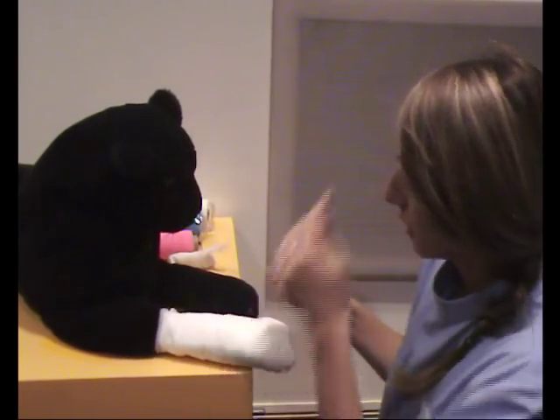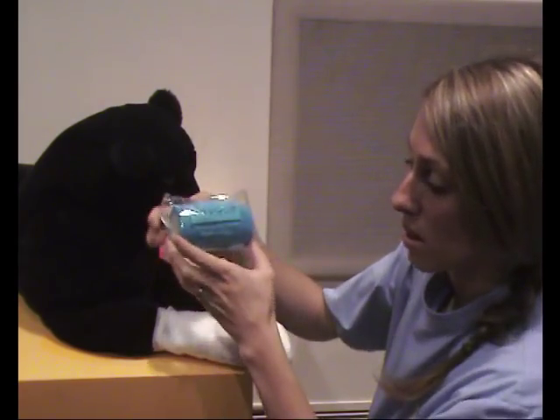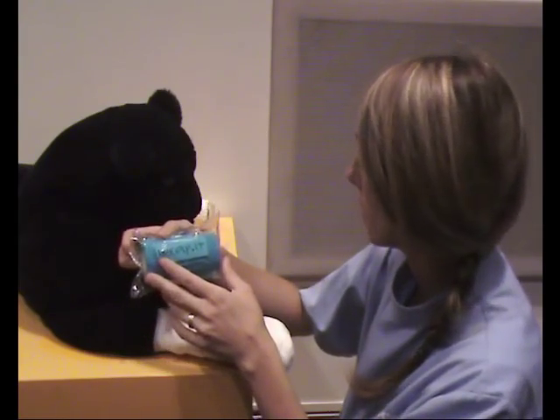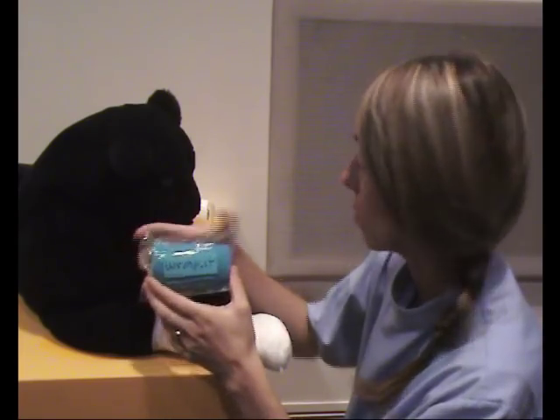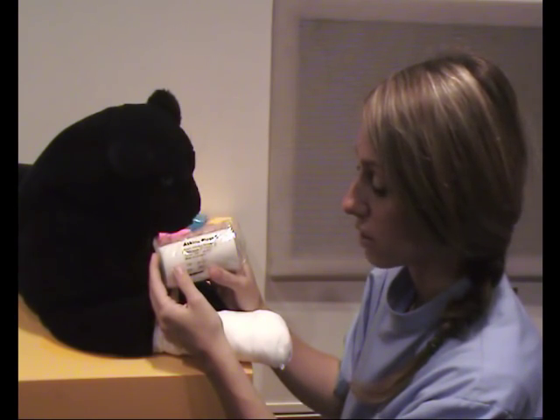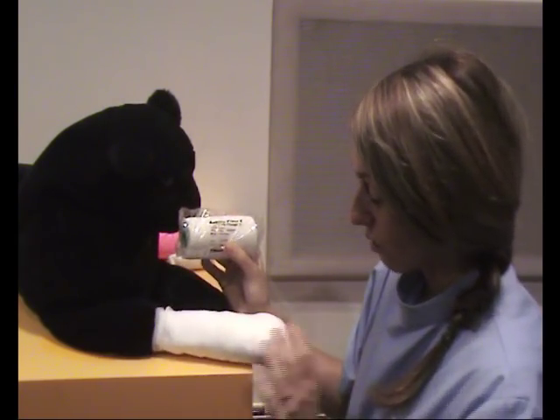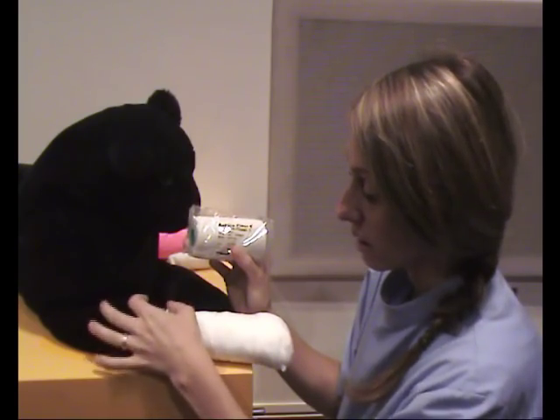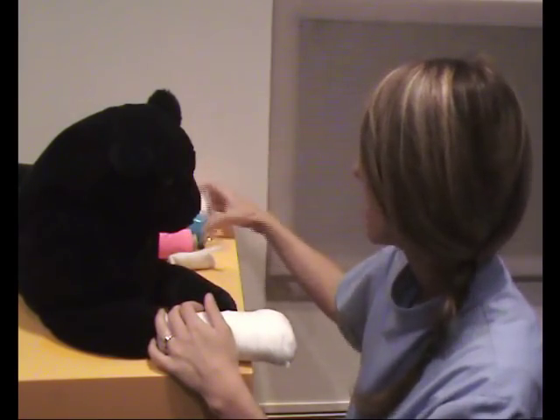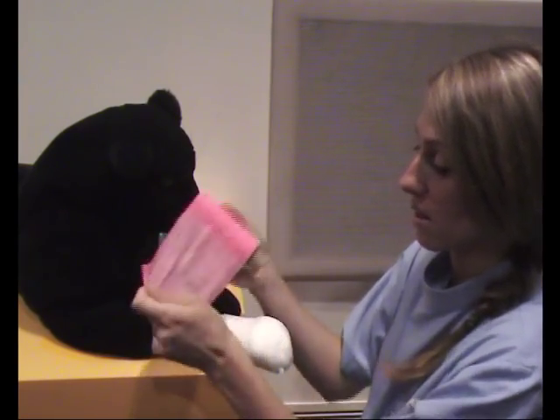The final layer, if you have it, should be something that sticks to itself — an adhesive bandage. There are two main types: cohesive non-woven bandage, also known as vet wrap, which is great to use and very pliable; and elastic adhesive bandage, also known as Elastoplast. Elastoplast is not as malleable as vet wrap but it will stick to the animal's skin, which helps stop slipping, though it's harder to get off.